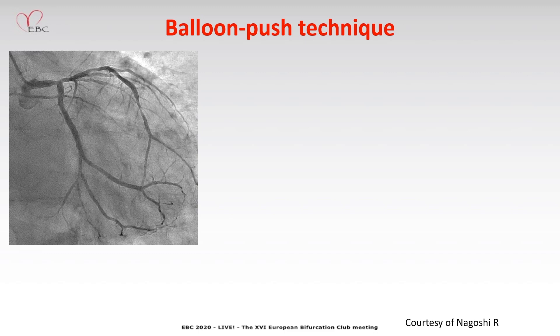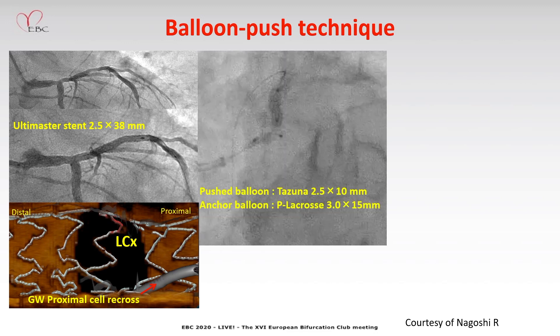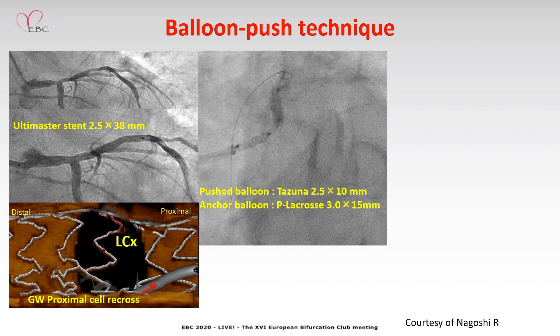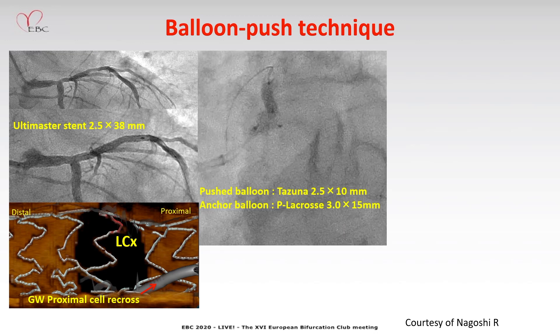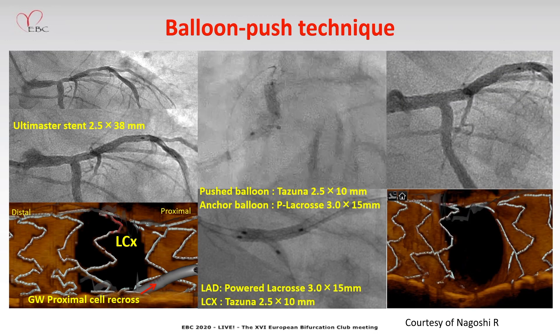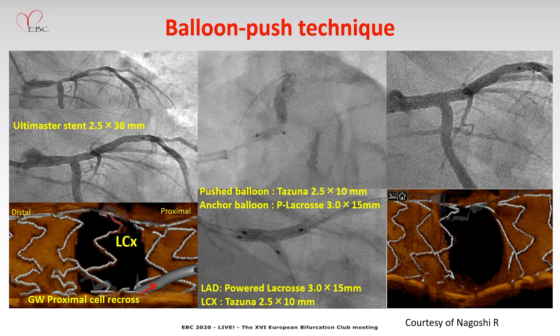This is the left main bifurcation region. Crossover stenting was performed, guidewire recrossing in the proximal cell. Under the anchoring of the LAD balloon, a 2.5 mm short balloon was pushed from the left main to the side branch axis. Final kissing balloon was performed. Here you can see good expansion was achieved at the side branch ostium and no stent struts in the side branch ostium.